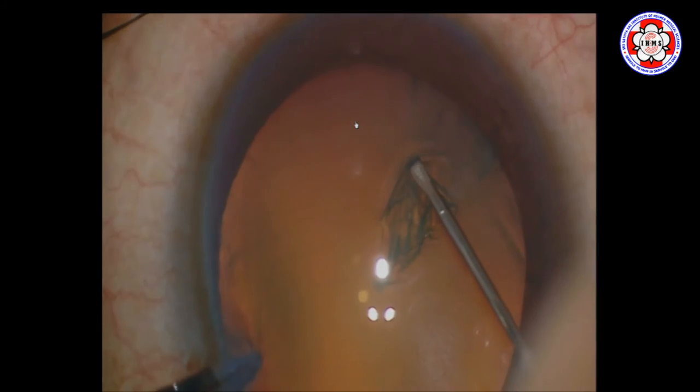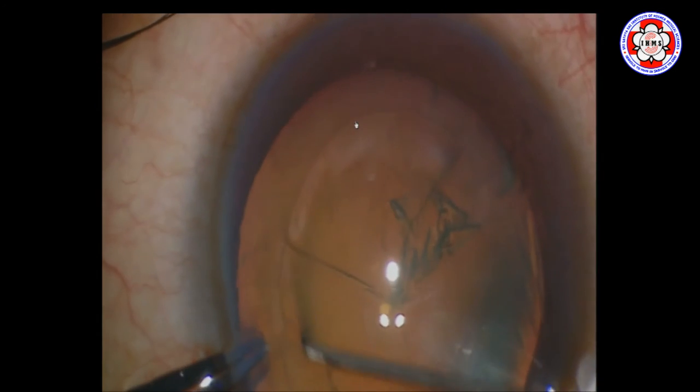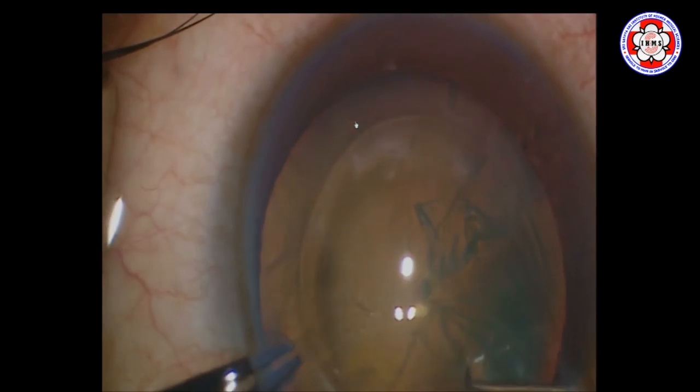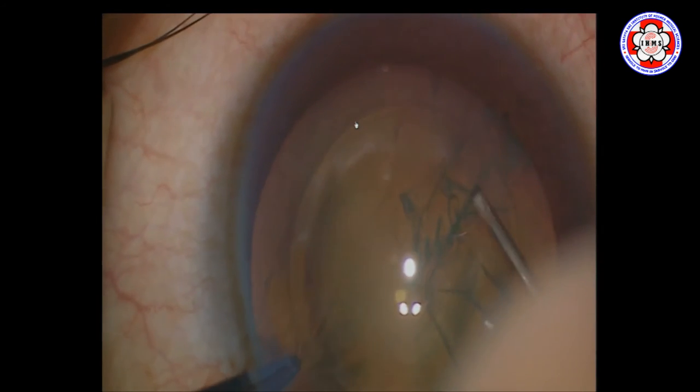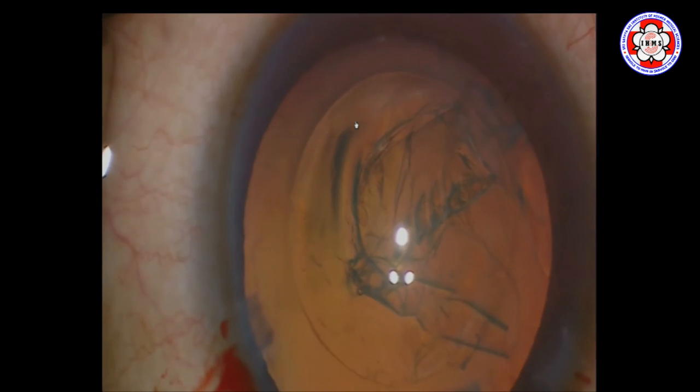One more similar video with higher magnification. It would sometimes go triangular — take one arm of the triangle, turn it over, flatten. That's the first thing; if you don't flatten here, everything is lost. Get it flat and start to move around. Steady the globe with the second instrument through the second side port. And there you have it again — very predictable if you follow the simple rules: keep the chamber deep, don't let viscoelastic come out, stabilize the eye, flatten the capsule, turn it round, and start with the chamber being a little overfilled.